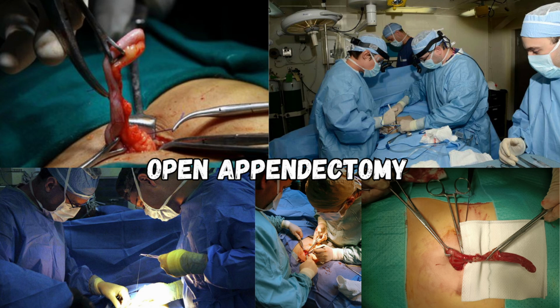Step 1. Positioning and preparation. The patient is placed supine under general anesthesia. The right lower quadrant is prepped and draped in sterile fashion. The incision is made over McBurney's point, located 1/3 of the way between the anterior superior iliac spine and the umbilicus.